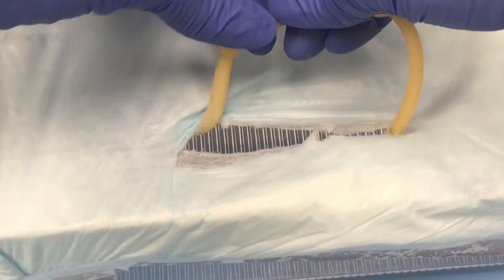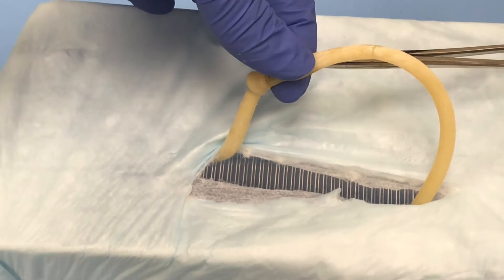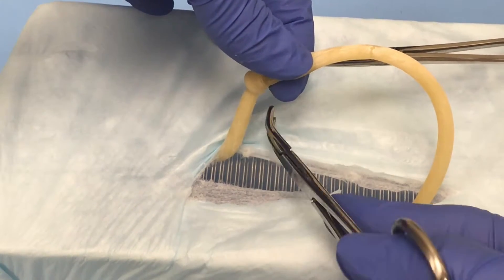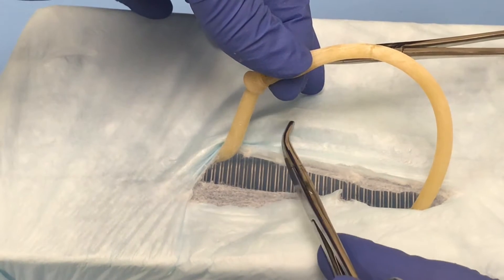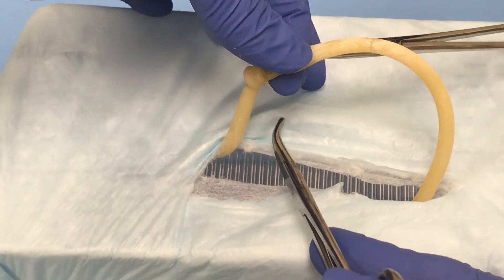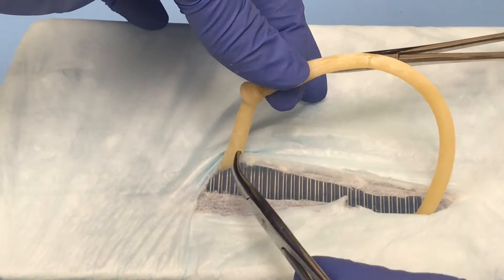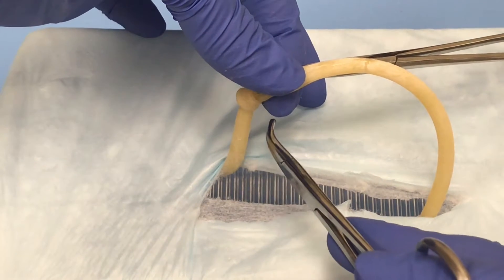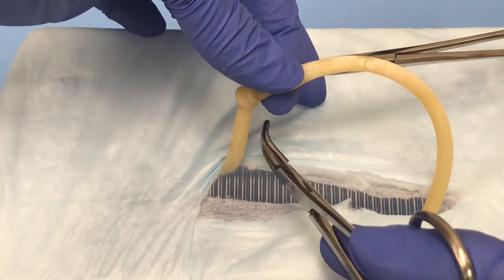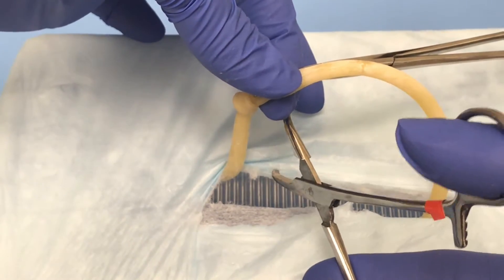After this you would go ahead and make a window into your broad ligament by pushing a clamp through the avascular portion of the broad ligament. You'll be able to see thickened fat and possibly vessels in the area of the pedicle, so you'll poke your instrument through in that avascular area and open your instrument up and down to make that window nice and wide.